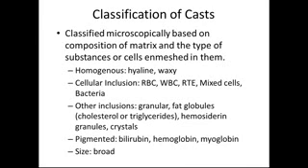We sometimes will see a few crystals in the casts, however this is not common. And then pigmented: they can be pigmented because of bilirubin, hemoglobin, or myoglobin that could be present, and the size is typically quite large and broad.